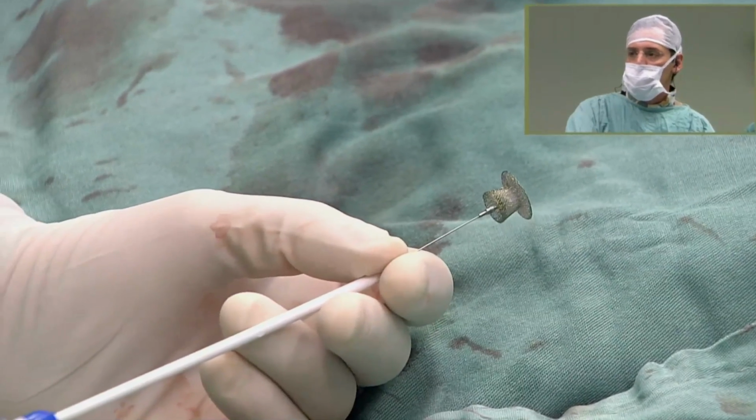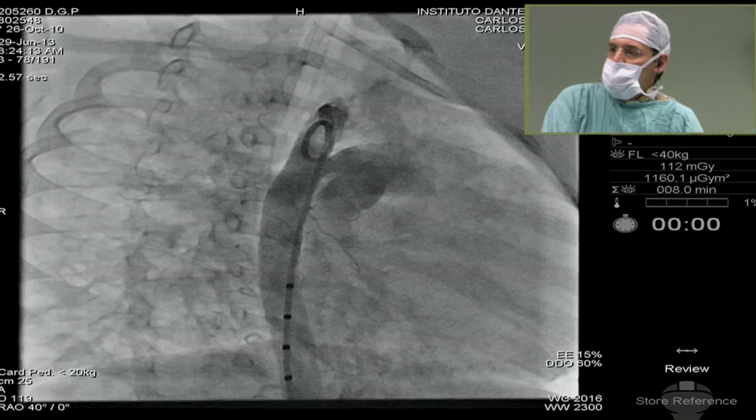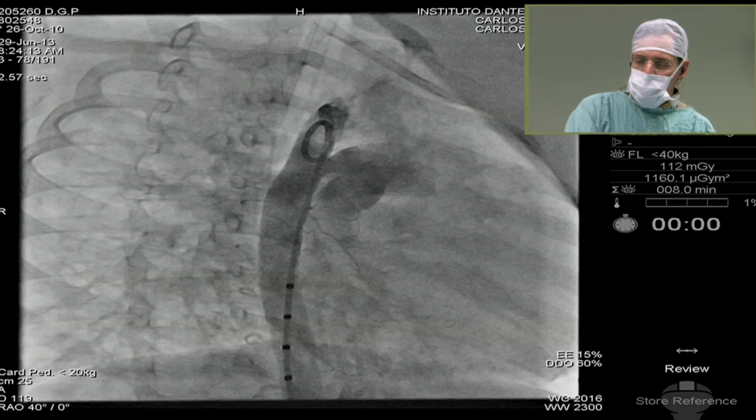No, let's go back to the screen, guys. Let's go back to the screen, yes. You have the aorta. So the markers are 10 millimeters. We had measured, it's about 12 millimeters, the aortic diameter, Zahid. Okay, so the circumference is 30. So the device 36. That we are going to try. The circumference would be 36, so. The circumference of the aorta will be around 36 then, right?